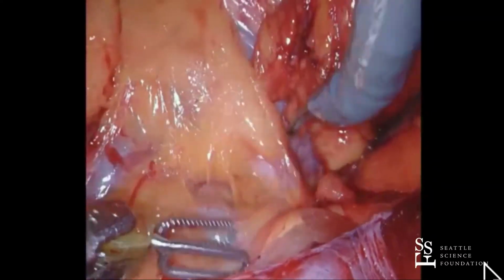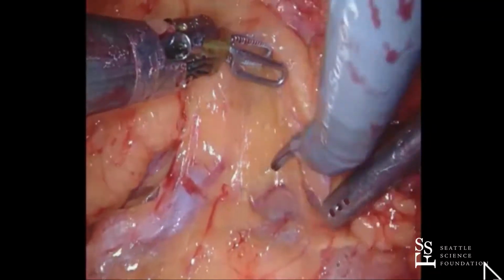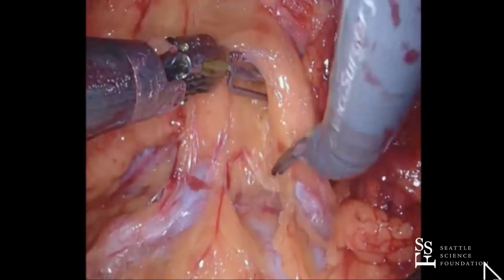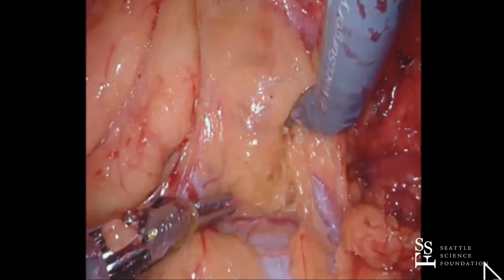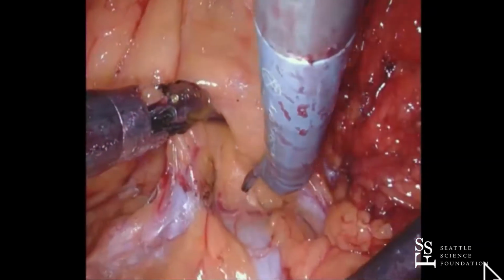So there's your ureter. So you can see how easy a pyeloplasty would be there. You're right on renal pelvis now, but just keep in mind that if you have a crossing vessel, it's going to be the opposite from what you're used to, transperitoneal.